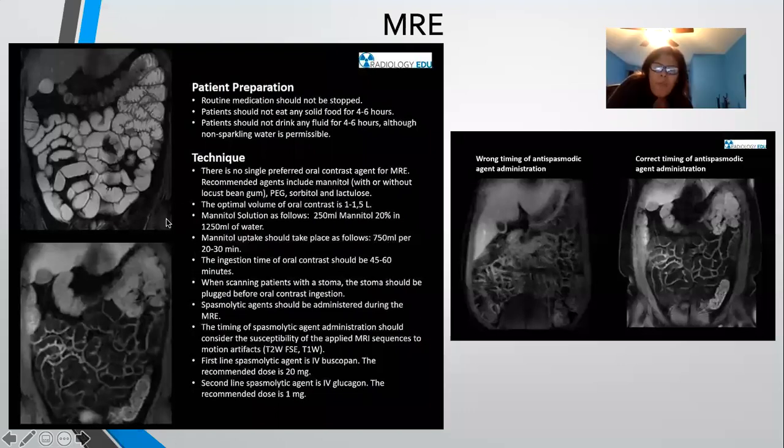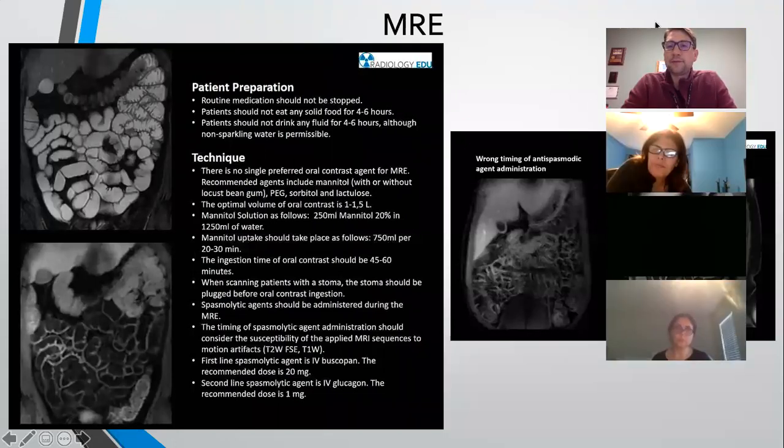Is this the common exam? The one that you talked about? Yeah, in places that you do abdomens, I know Winship does some of them. They've probably changed their protocol around a little bit. Some places they're not having the patients drink the volumen anymore. Main campus does them. Main campus will do enterographies. Anywhere where you have inpatients with Crohn's disease, they'll do enterography quite a bit. Outpatient procedures, not really.